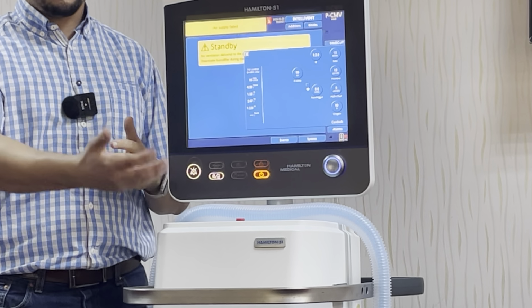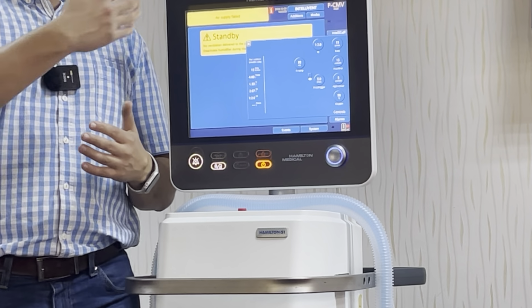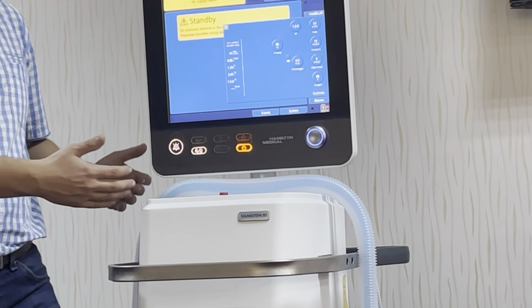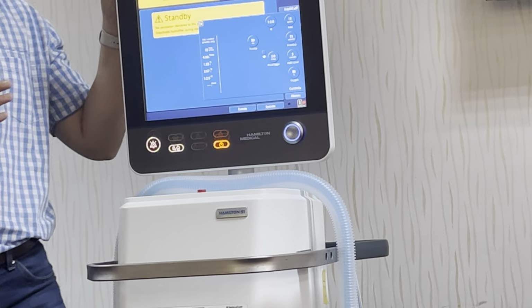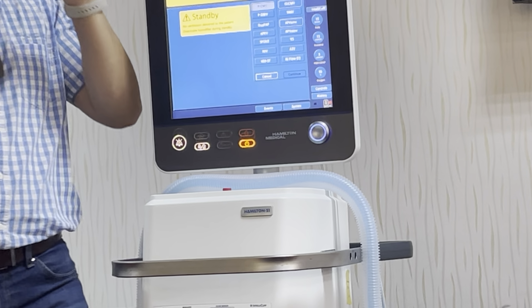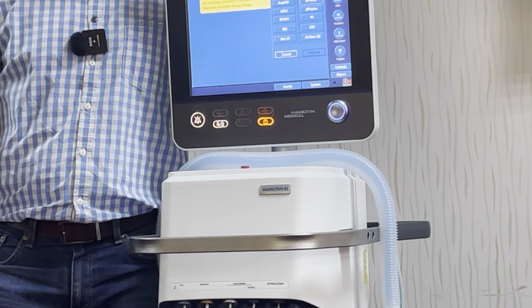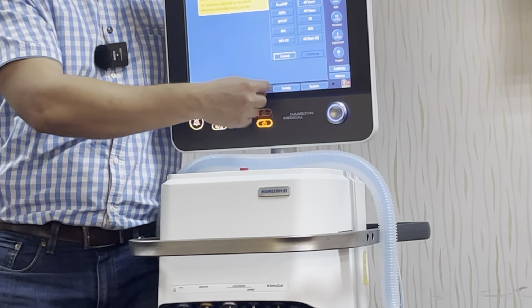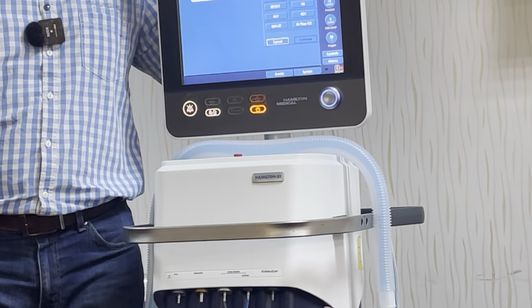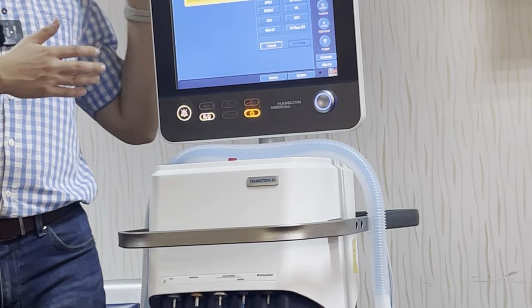So what will be the reaction if the machine detects any spontaneous breathing? The machine will provide support for the patient. So the patient is now able to breathe with support from the machine, even if he is in CMV mode or PCMV mode. Otherwise, it is going to work as mandatory. That's why they add the letter S in between. S means synchronized. CMV is originally a non-synchronized mandatory mode, but because of the trigger parameter that has been added, the upgraded CMV mode becomes synchronized CMV.